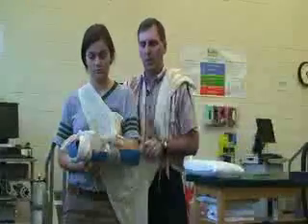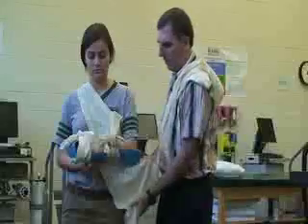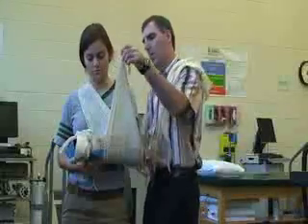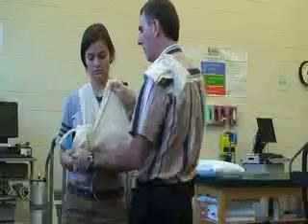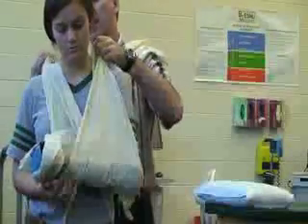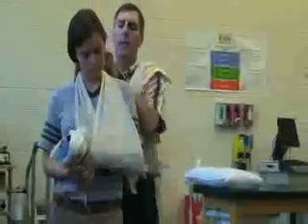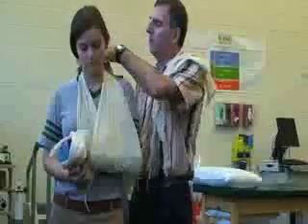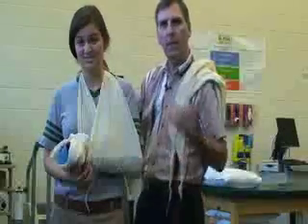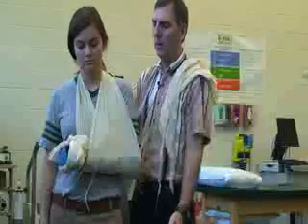Up over the good shoulder. Then this one is going to come up, supporting the arm as much as possible. Before I tie it down, I would hold this here to see if it supports — if it needs to come up higher or lower.